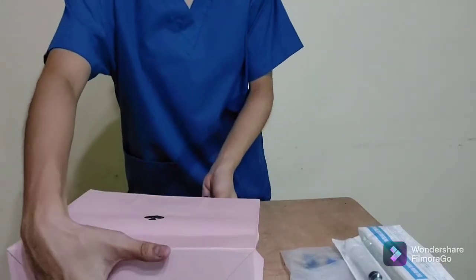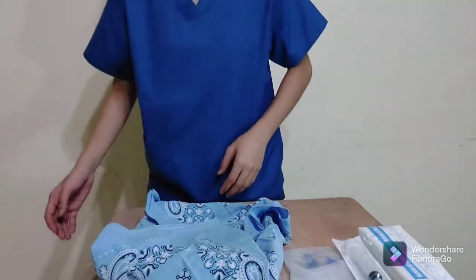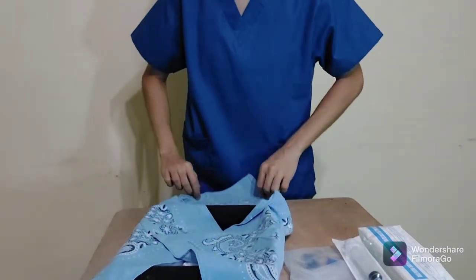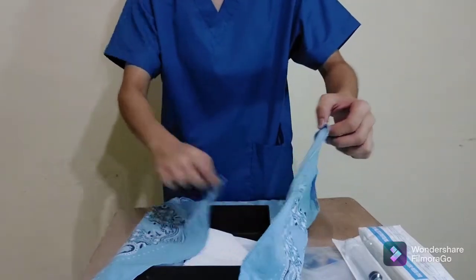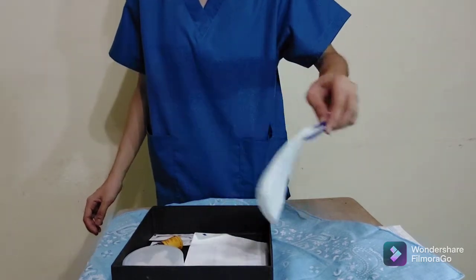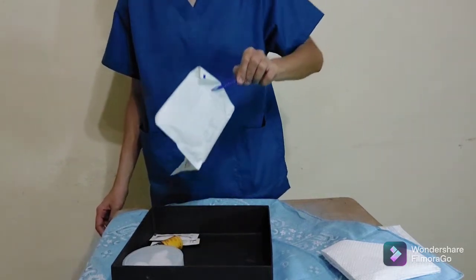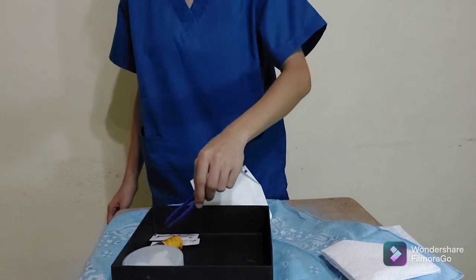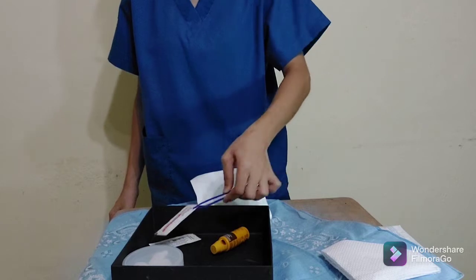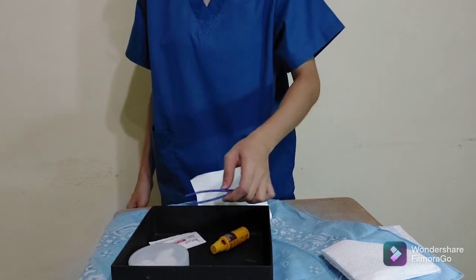Inside the catheterization kit, here is the forceps, the drape, the gloves. Also here is the betadine, the lubricating jelly, and the cotton with cleansing solution.